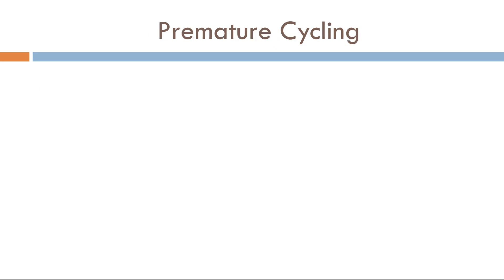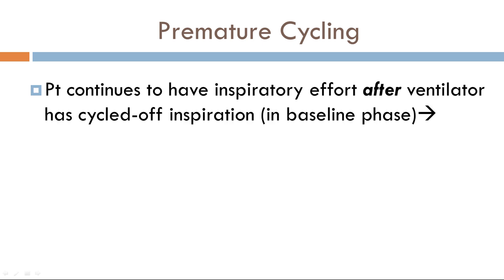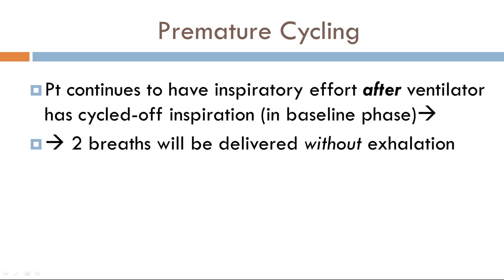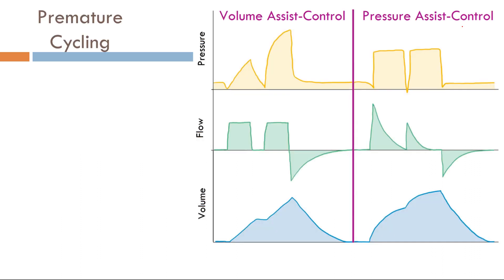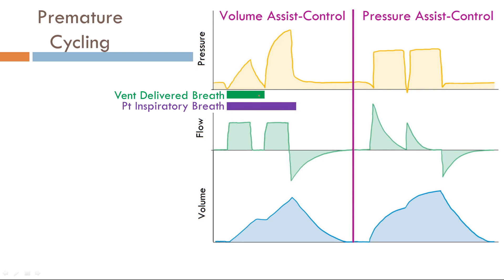In premature cycling, the patient will continue to have inspiratory effort after the ventilator has cycled off inspiration or terminated the breath. One distinguishing feature about premature cycling is that two breaths will be delivered without exhalation. Premature cycling looks different in volume assist control ventilation and pressure assist control ventilation. Here, the green line designates what the ventilator has delivered, while the purple line shows the patient continues to inspire even after the ventilator has cycled the breath.